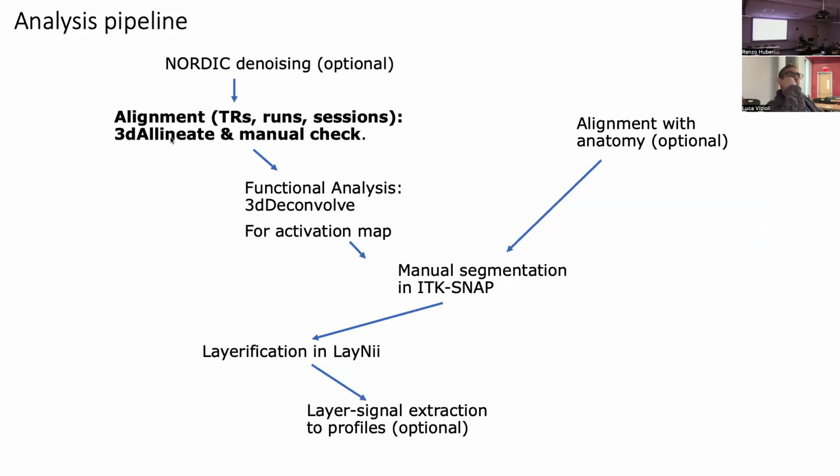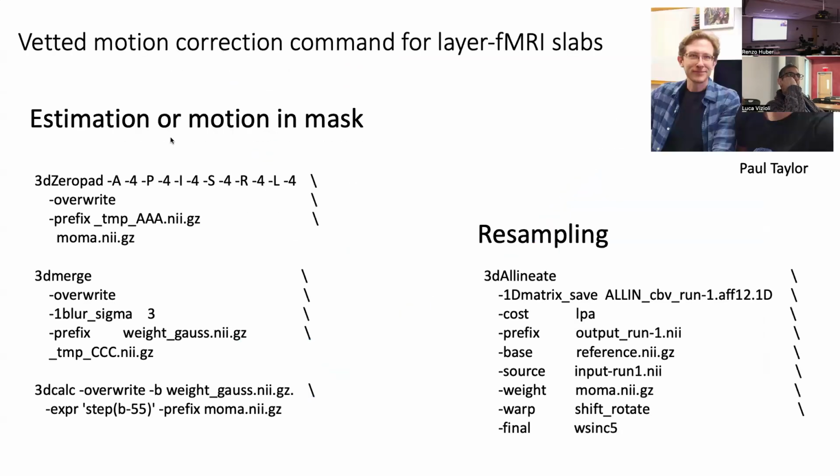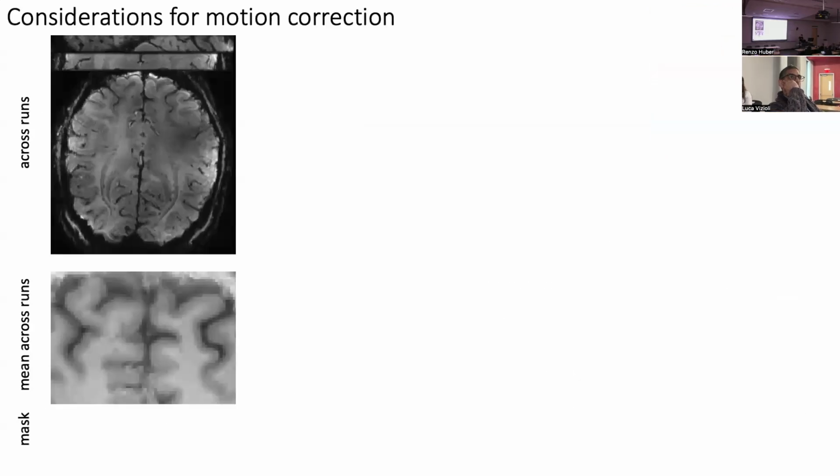And next, I want to justify my choices in alignment. Maybe I want to borrow John's way of separating the alignment problem into estimating the alignment and then doing the regridding. So first we have the estimation of the alignment, where I will pay a lot of attention to the mask, basically on how we capture this alignment.